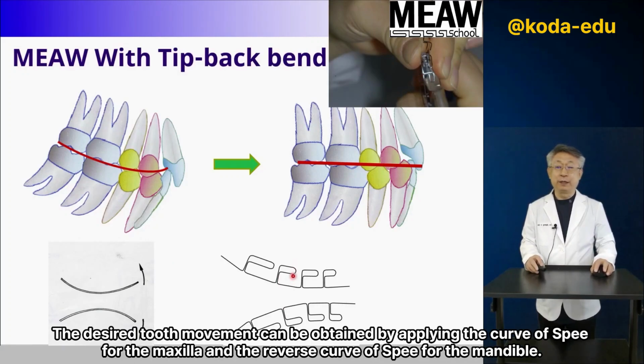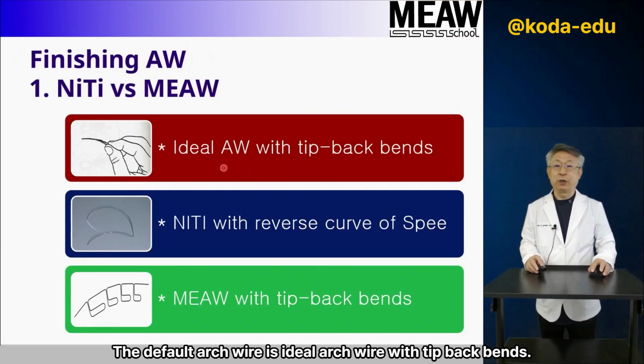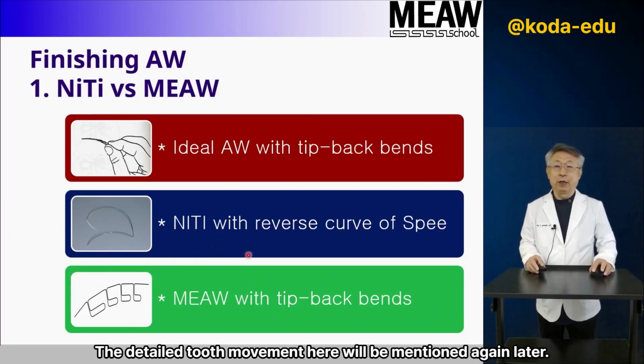The desired tooth movement can be obtained by applying the curve of Spee for the maxilla and the reverse curve of Spee for the mandible. In general, there are various types of arch wires used in the finishing stage. The default arch wire is an ideal arch wire with tip back bends. The second is a nitinol arch wire with a reverse curve of Spee. Next is the MEAW wire with tip back bends. The detailed tooth movement here will be mentioned again later.